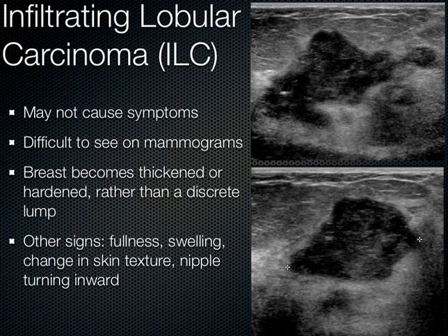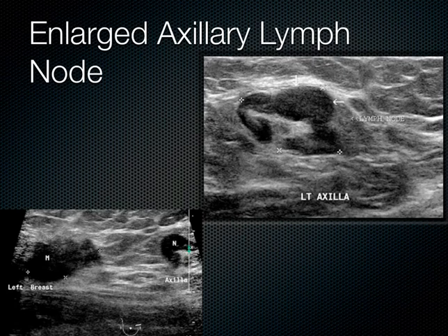It has a tendency to become really more multifocal, so you can see this in different areas of focality, and with really the same prognosis as that of a ductal carcinoma. And this ultrasound image here is of the left axilla in a patient basically who's got these hypoechoic group of lymph nodes, and the metastasis is seen here.